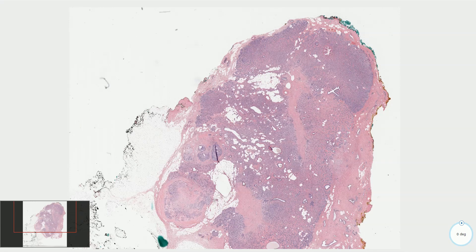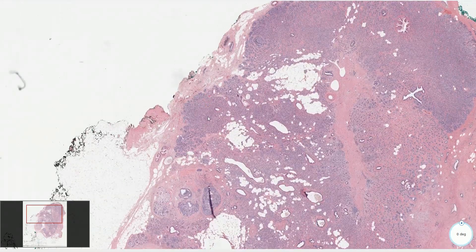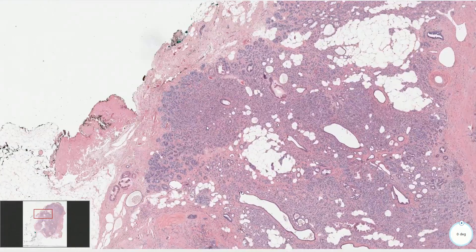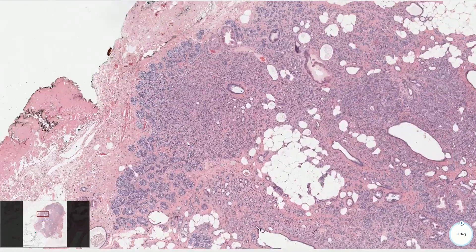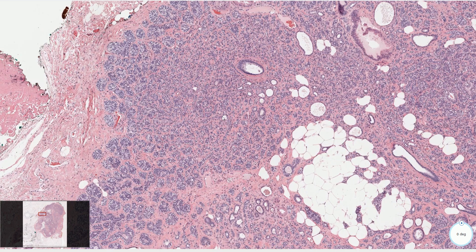On low magnification we can see a partially lobular appearance, and some cases are associated with central sclerosis or fibrosis. If we go closer we can see relatively closely packed aggregates of cells, which might be worrisome especially in core needle biopsies.